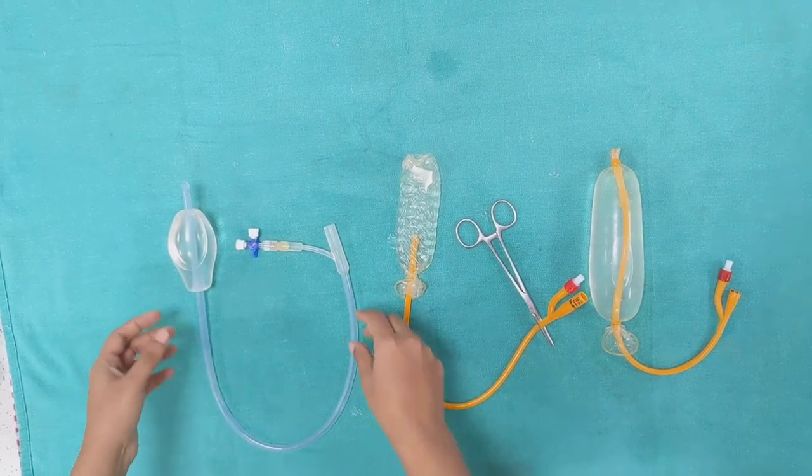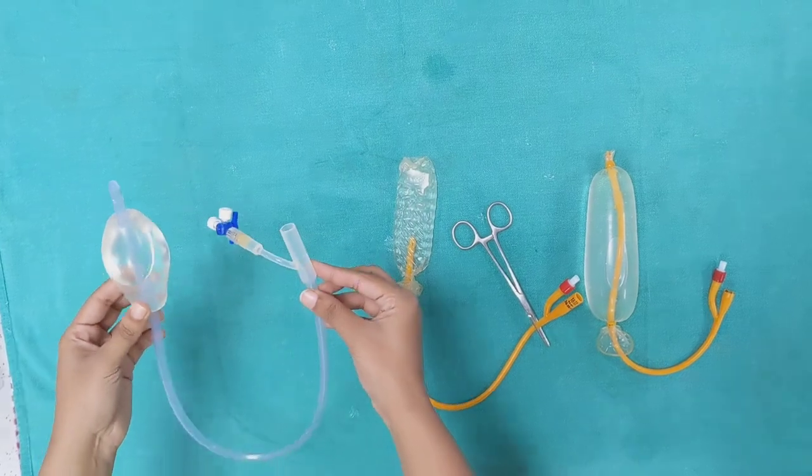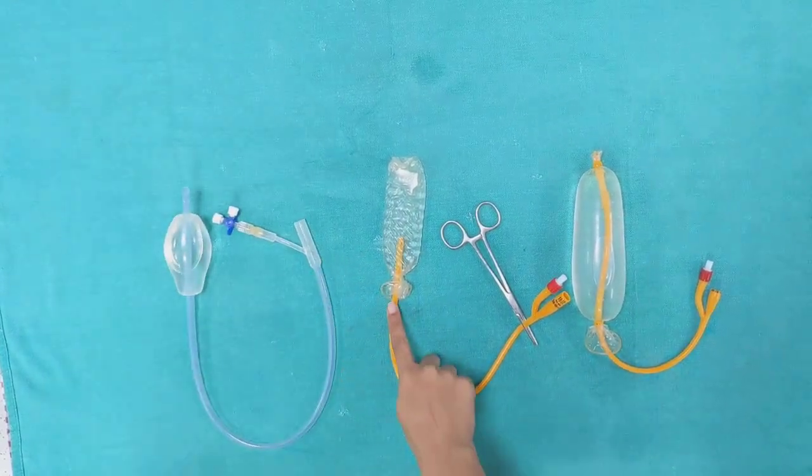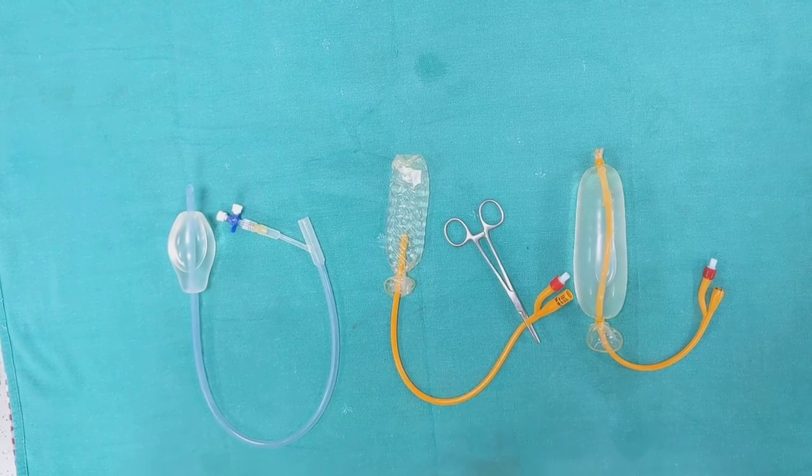Good afternoon everyone. Today we are here to study the various components of a Bakri balloon and how it is used in atonic PPH. We shall also study the various modifications of condom catheters that can be used in a low resource setting.